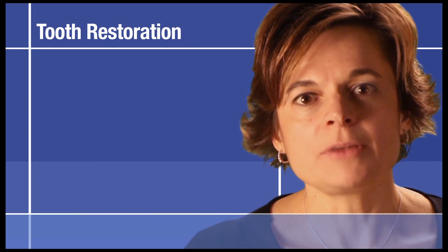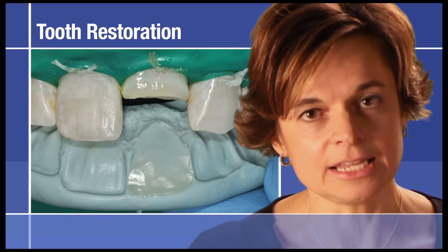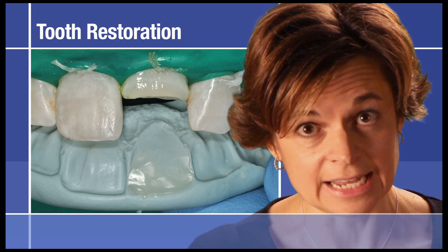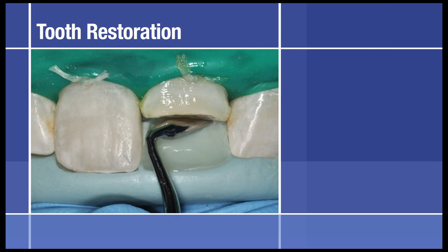And after etching and bonding, we go with our lingual matrix. So again, this is done in the index, in the putty matrix index. A1 enamel, very thin layer, attached to the tooth with an instrument, cured in place, and then this putty matrix is removed. We end up with a very nice lingual shell.